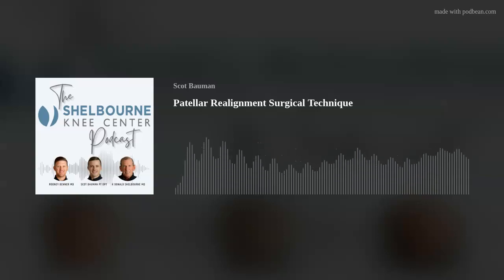A lot of people are hesitant, if I talk to other surgeons about that, to put a plate on the anterior tibia, especially on the tibial tubercle, in thinner people where there's not a lot of soft tissue. The plate that we use is a small frag third tubular plate. It's a pretty low profile plate, and when you contour it to the tibial tubercle, only about 20% of the time, I would say, do we have to go back and take the hardware out. Almost always, it's not that prominent for people, not that symptomatic for people, and that we can leave it in.